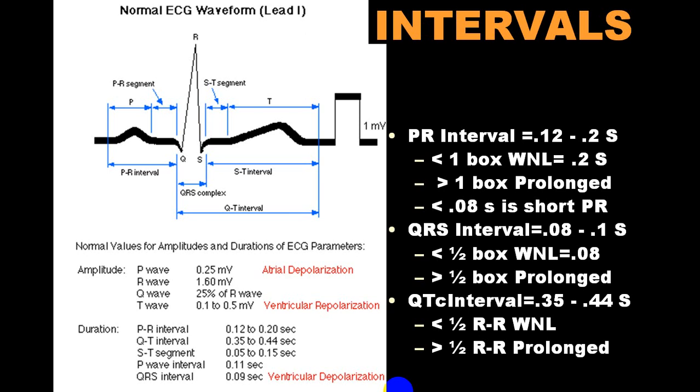In this particular lecture we are not going to discuss the QRS interval in detail, but the QRS duration is 0.08 to 0.1 second, that is two to two and a half small boxes, but not more than three small boxes, that is 0.12 second. When it is more than 0.12 second, we call it a broad QRS complex. Normal is between 0.08 and 0.1 second. So that is a normal QRS. There is no disorder where you get a narrow QRS complex.